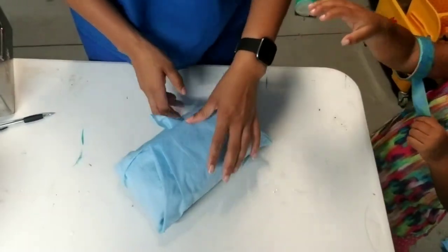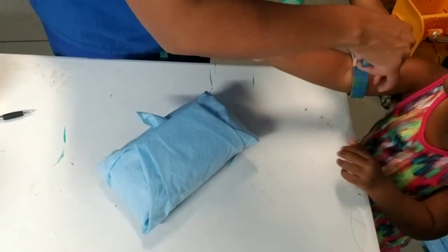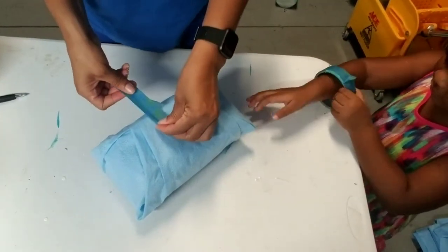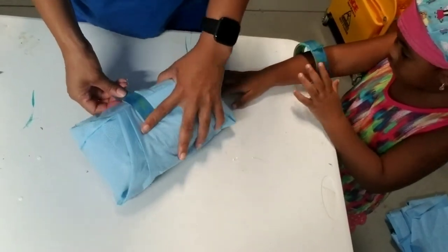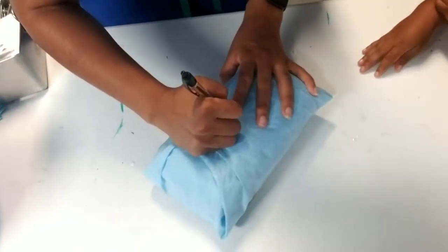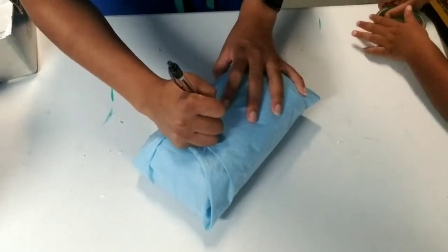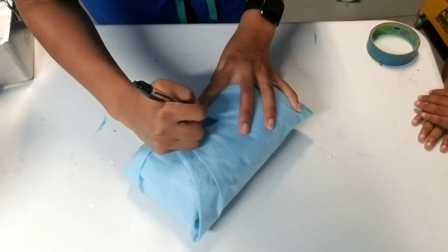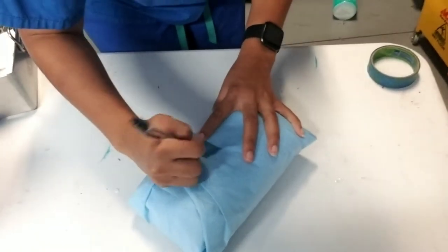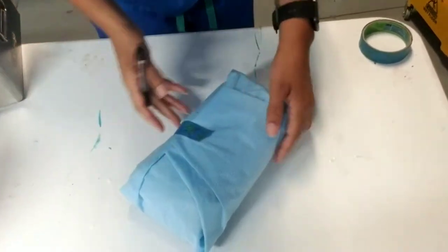Once it's wrapped, get your tape and place it partially over the tab. Then label it with the date, what it is — this is an eight-pack of towels — and your initials.